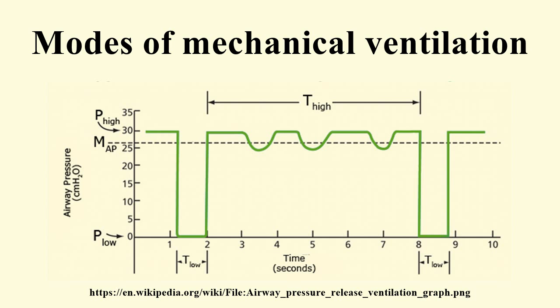The taxonomy is based on these theoretical constructs and has 4 hierarchical levels: control variable, breath sequence, primary breath targeting scheme, secondary breath targeting scheme. The primary breath is either the only breath there is or it is the mandatory breath in IMV.